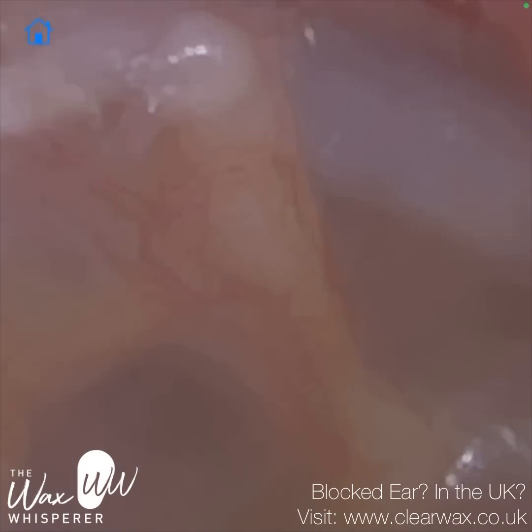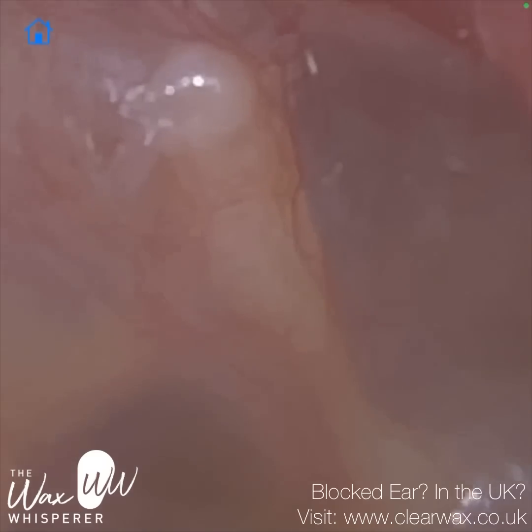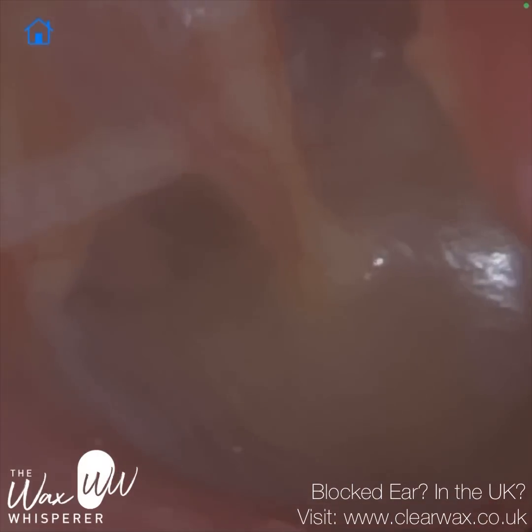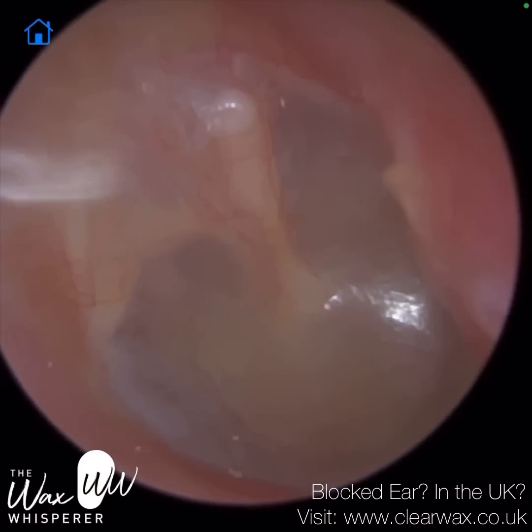It did throw me at first because, obviously, when we see the eardrum as close as this with an endoscope, my brain is wired to make me think I'm putting the endoscope further into the ear. But the endoscope's not in the ear deeply, so I was a bit cautious. Every time I zoomed in, I was like, oh God, I've got the endoscope too deep in the ear, and I partly came away with it. My brain has to rewire itself to reassure me that I'm not putting the endoscope further in — all I'm doing is zooming in.